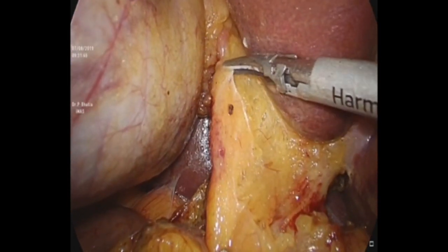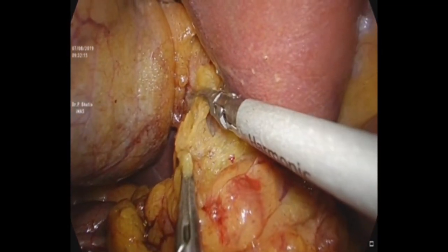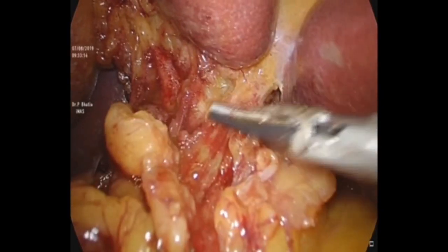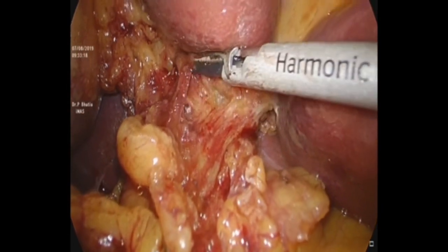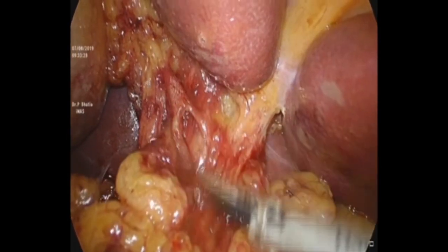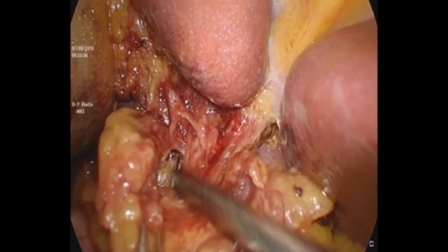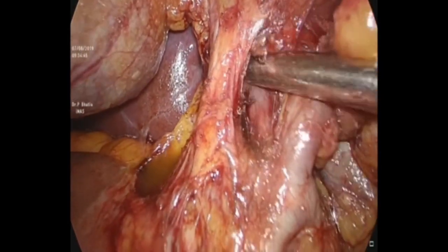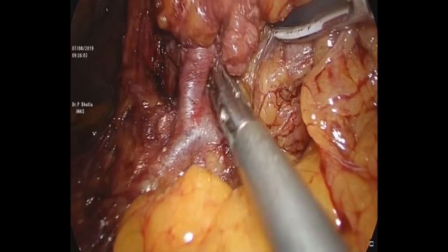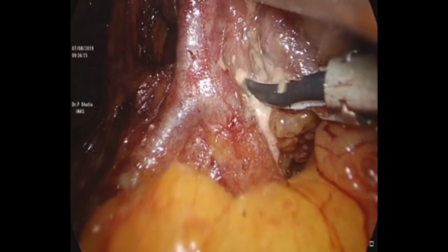The hilar plate is cleared of all fibro-fatty tissue step by step — first the hepatoduodenal, hepatogastric, and hepatocystic triangles. All the fibro-fatty tissue is dissected off and then one starts mobilizing the three structures. The advantage of laparoscopic radical cholecystectomy is that we are able to see even the retroportal vein area, which was initially thought surgeons would not be able to achieve, and that is why open surgery was still reserved for that.